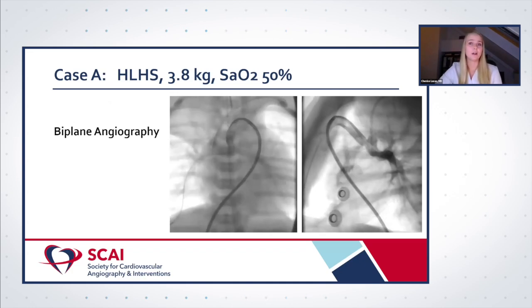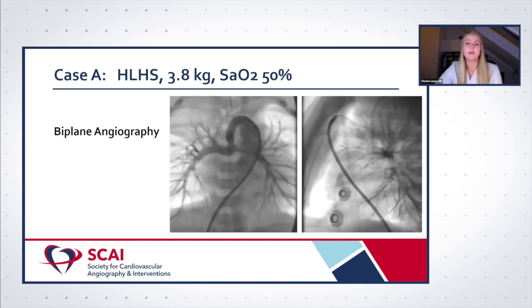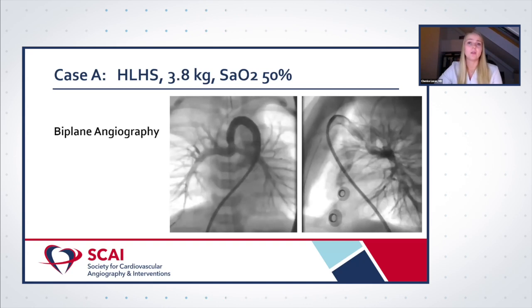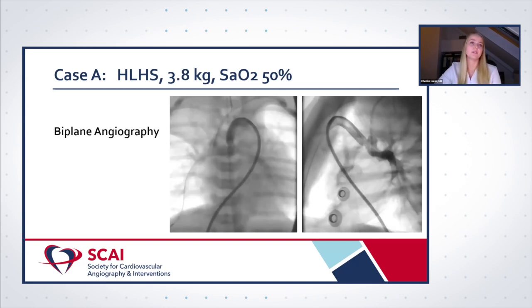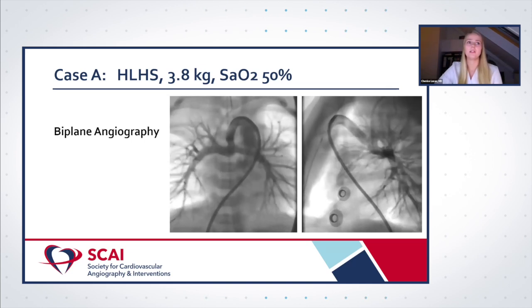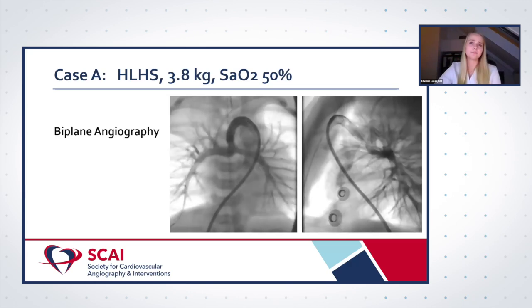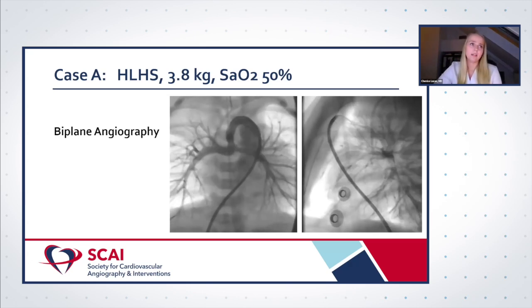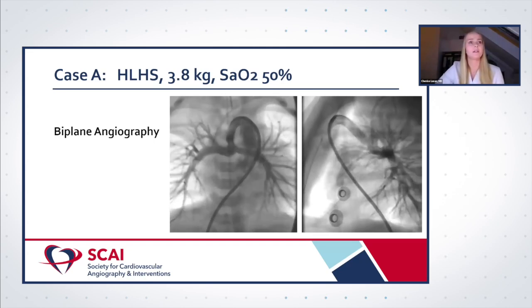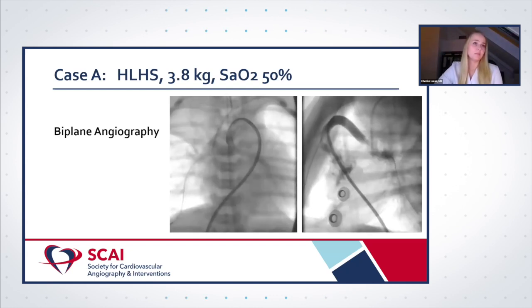So, of course, we performed echocardiography, but echocardiography showed a good right ventricular function and an unobstructed RVOT to a Sano connection. So the only thing that the echocardiography did show was a turbulent flow in the Sano to pulmonary artery anastomosis. So then biplane angiography was performed in multiple angulations, of which you can see 2 images right now on the screen. And on these biplane angiographies, there was no evidence for uneven contrast distribution, no stenosis or pulmonary hypoperfusion.